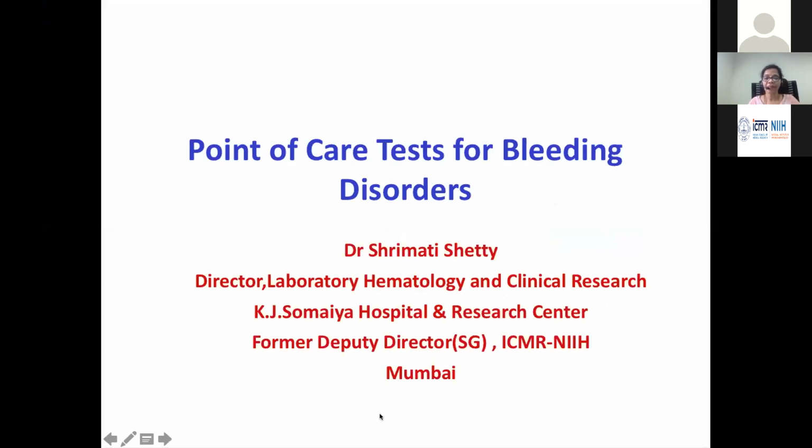Yes, ma'am. All right. This is the point of care test for bleeding disorders, which we have developed at ICMR NIIH. We have developed it for the two commonest bleeding disorders, that is hemophilia A and von Willebrand disease.